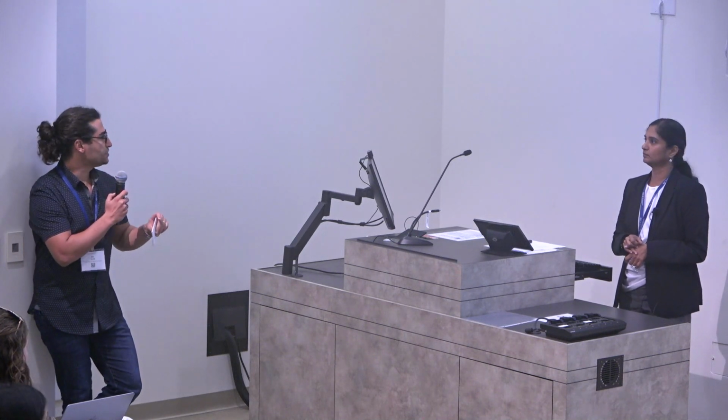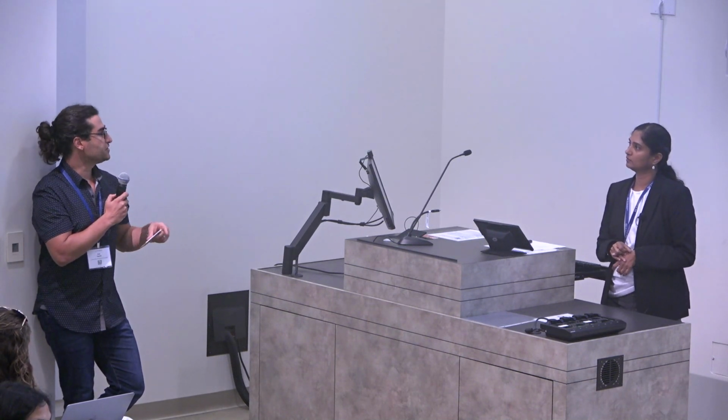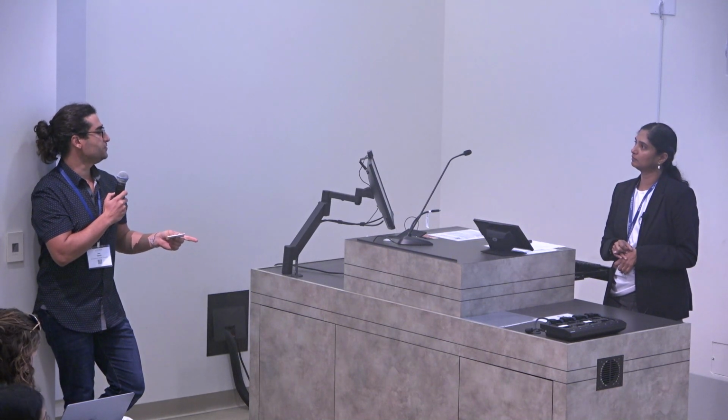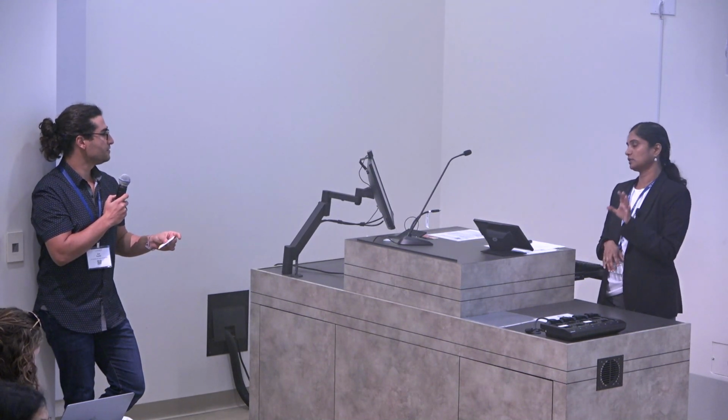And then another question based on your answer to the last question. So the clinician is only using the T1 post to do the segmentation. Is that right? No, they do use all other images for comparison, but they do the segmentation on the T1C. Got it.